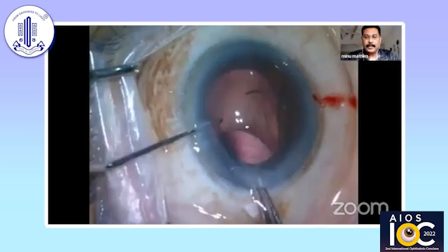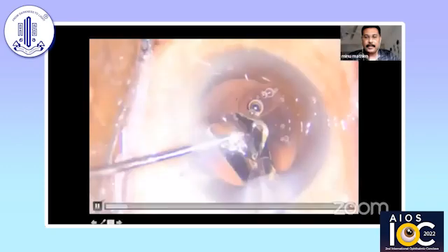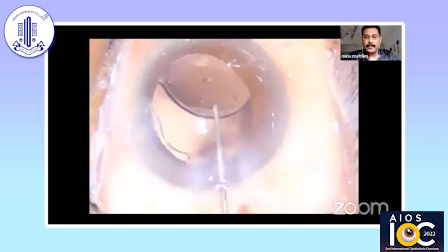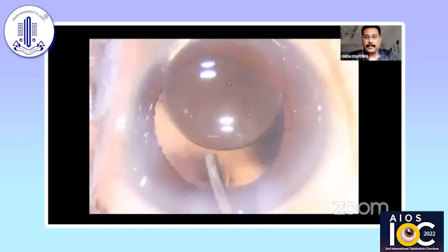You can notice that the leading haptic is stuck between the injector plunger and the nozzle. Once it comes out with a shudder, you find that the haptic is not completely in. It is better to inflate the bag with sodium hyaluronate and get your lens in properly.